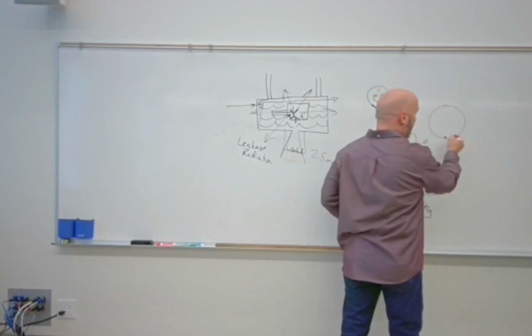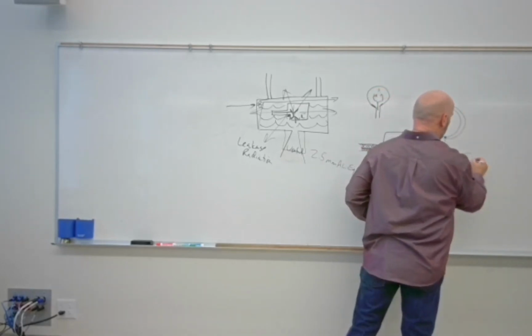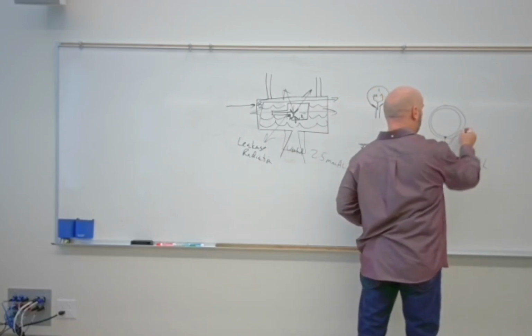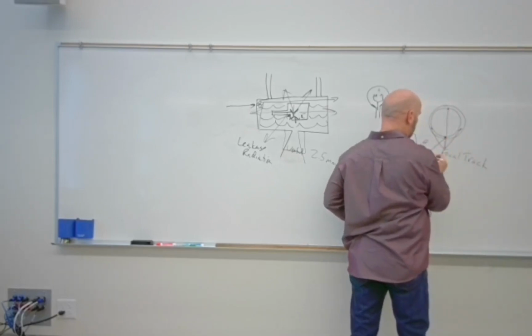It always changes. And that entire area is what we refer to as the focal track. Okay? So the area of bombardment is the target area, and all of that is the focal track.